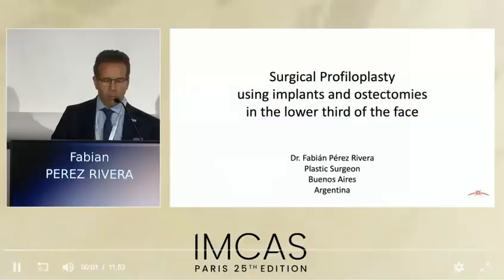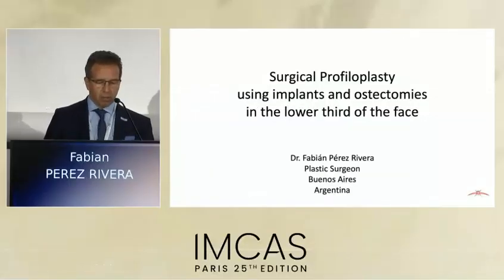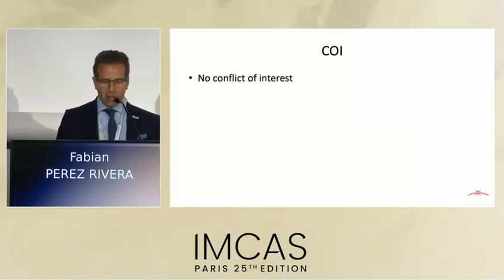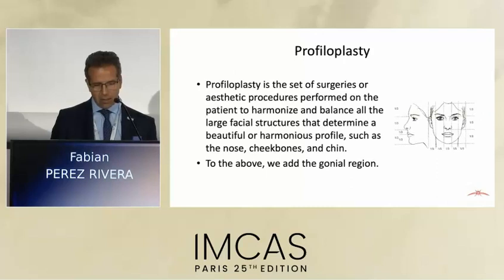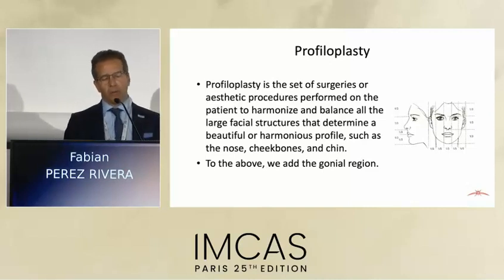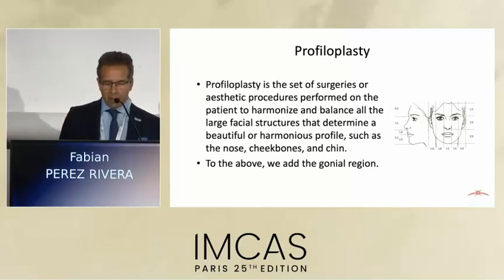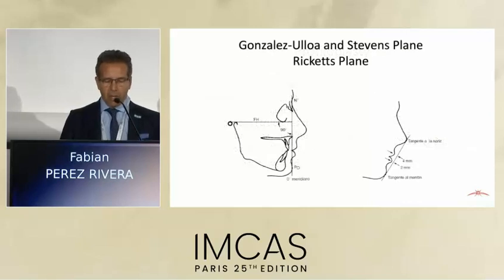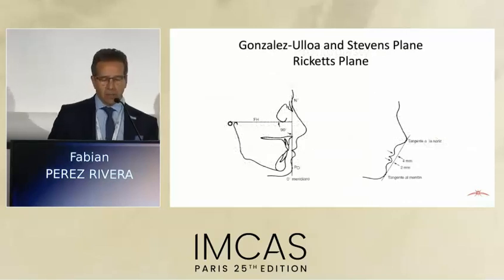Of the surgical profiloplasty using implant and ostectomies for the lower third and the middle third of the face. No conflict of interest. For me, profiloplasty is the way to obtain a balance, harmonize the face, not only thinking about the nose, as we usually do, but at the same time the malar area, the chin, and I add to the harmonize for the face, the gonial area too.